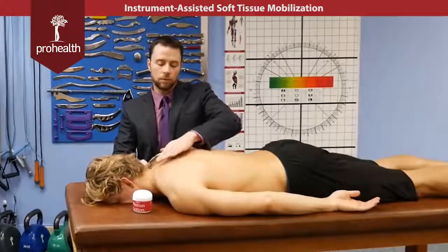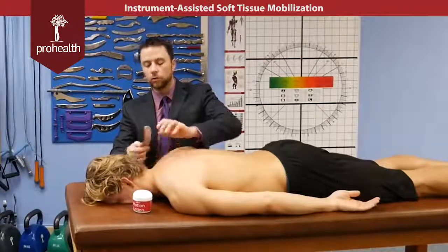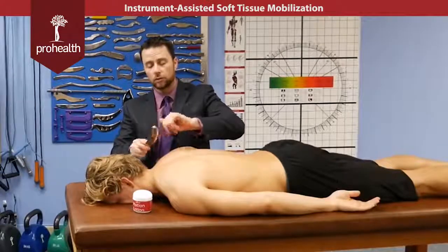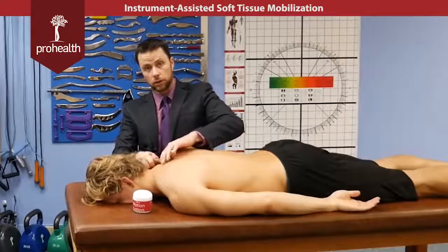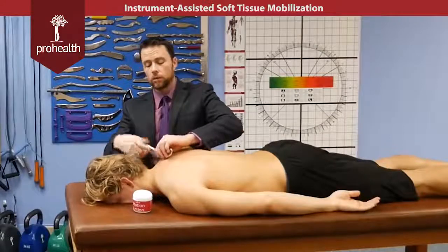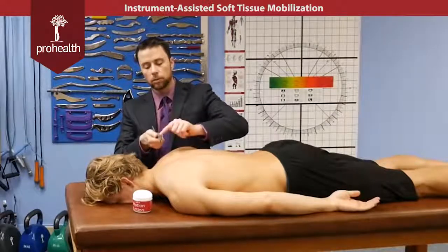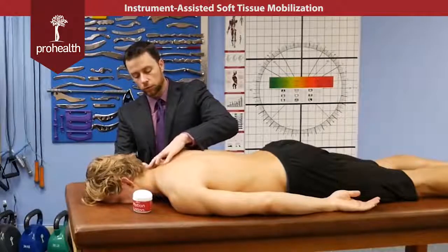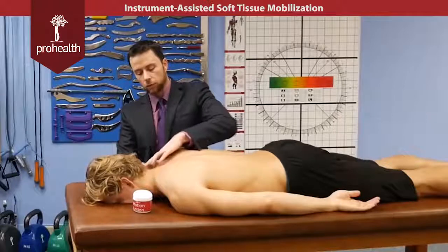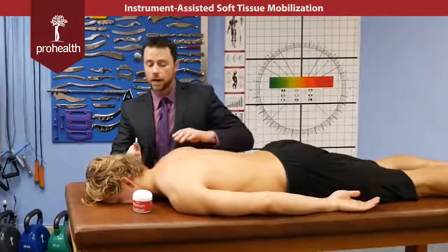So you start off nice and quick, find your area that you want to scan through and maybe spend a little bit more time. Simply flip the instrument over, go from concave to convex edge, and you can actually give a little bit more specific pressure over top of that region. If you wanted even more than that, you could flip the instrument around. This edge goes from dull to a little bit sharper in this area, and you could start to dig in and get a very specific contact working on those knots or adhesions that you might find in that area as well. Okay?